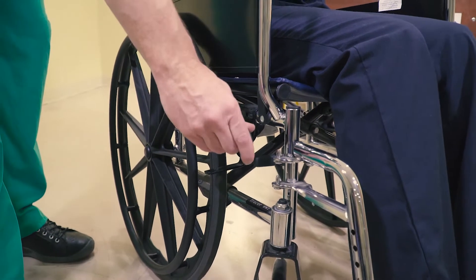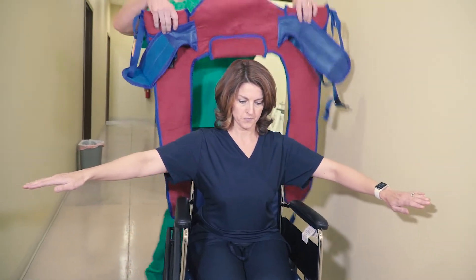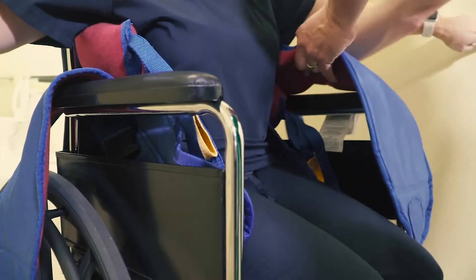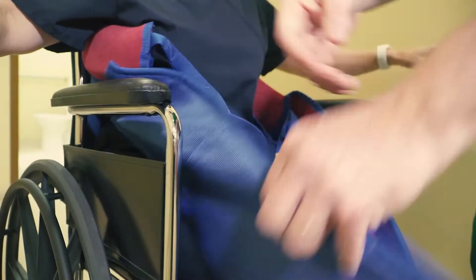Start by locking the wheels on the patient's wheelchair. Ask the patient to lean forward and tuck the sling in behind them. Next, pull the leg straps along the outside of the patient's legs, making sure that the straps don't catch on any part of the wheelchair.